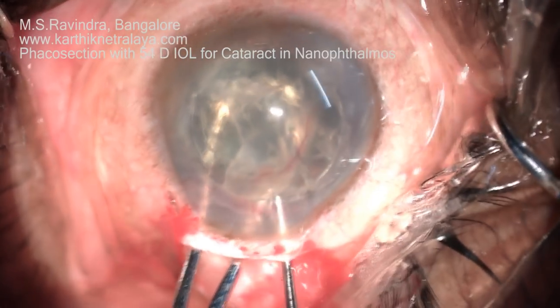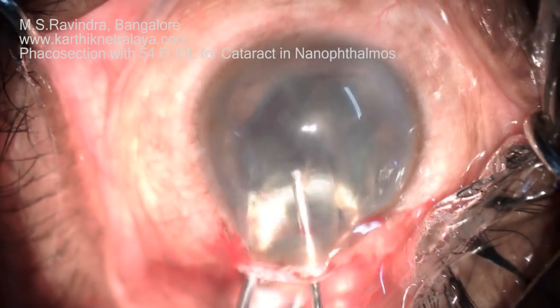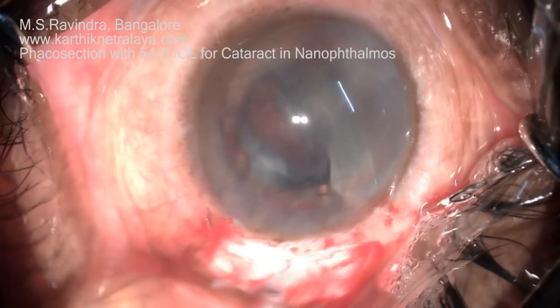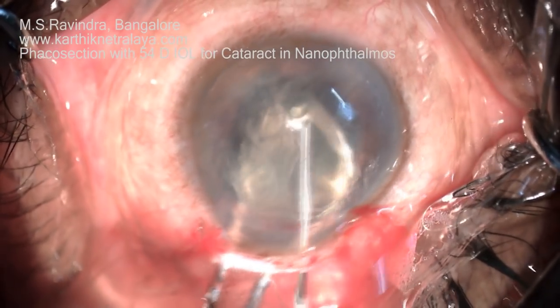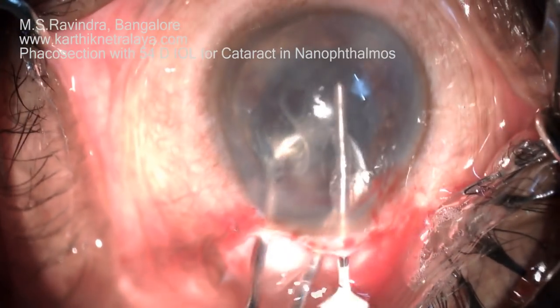Visco is being injected to separate the nucleus in the anterior chamber from the endothelium. It is bisected into two and extracted. It is basically a large visco expression, but the nucleus is being guided out by the wire vectis.